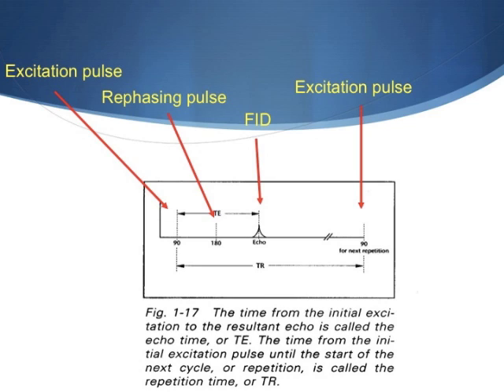So what do we do then? We hit it with a rephasing pulse, represented here as your 180. A 180 degree RF pulse spins the proton around on the track so that the slow proton is now in the front, the fast proton's in the back, and they're still going at the same speed as they make their revolutions around the wobble as it goes back to the longitudinal state, or the z-axis.